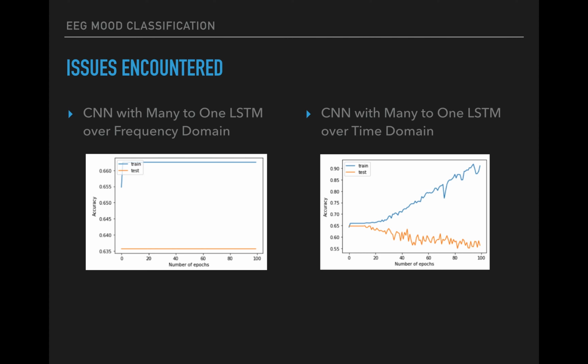Issues we encountered at first was feeding the data into the LSTM layer. This was later solved by understanding that the LSTM layer required a 3D input and required us to reformat our data.